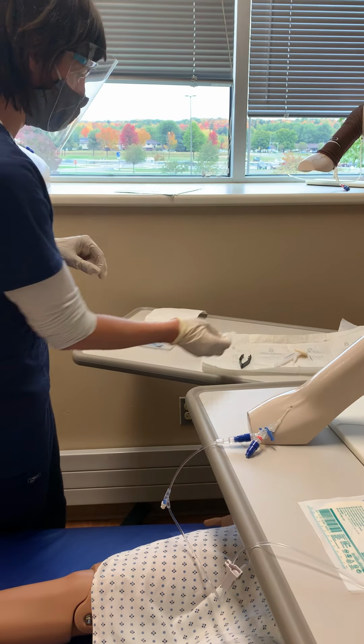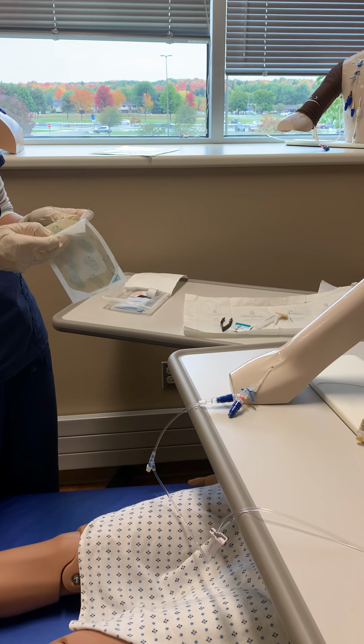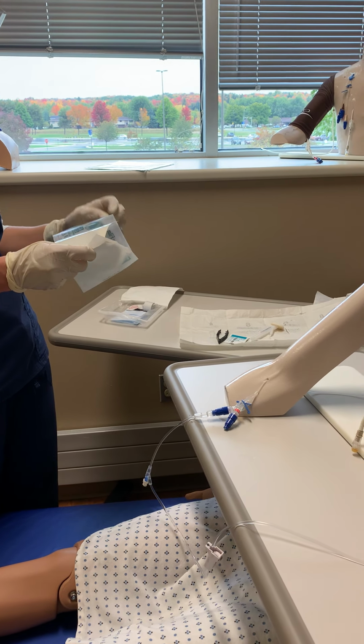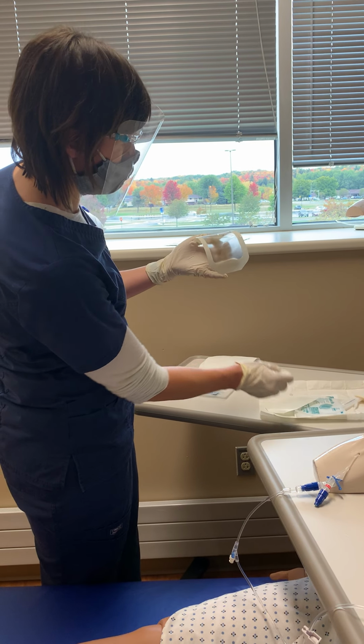Last thing I want to do, I'm going to make sure that my Tegaderm stays sterile. Touching only the edges. I do have gauze and tape in there if I needed it, but I don't feel like those are necessary at this time because it didn't need propped. So, keeping this sterile.